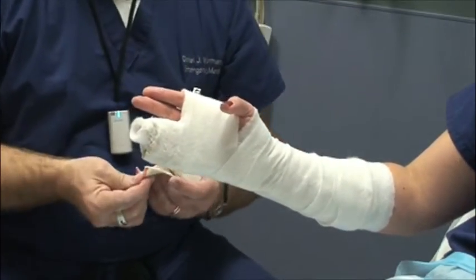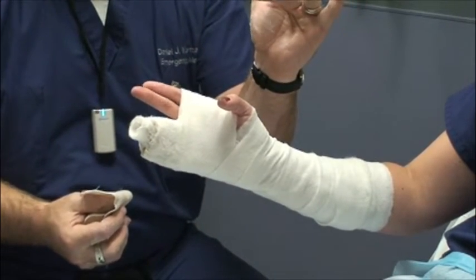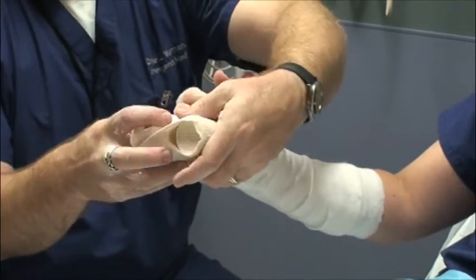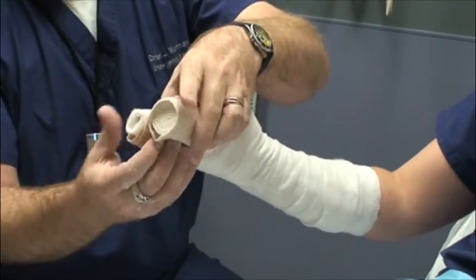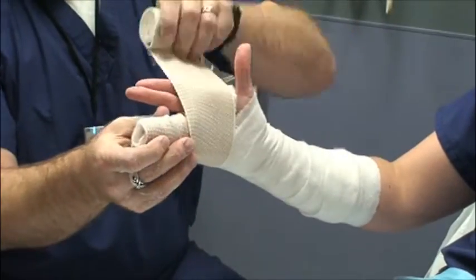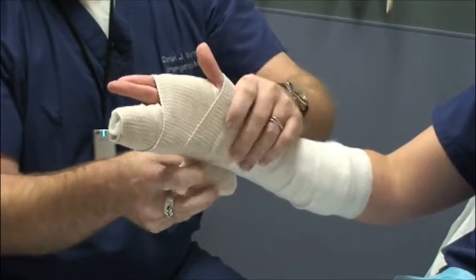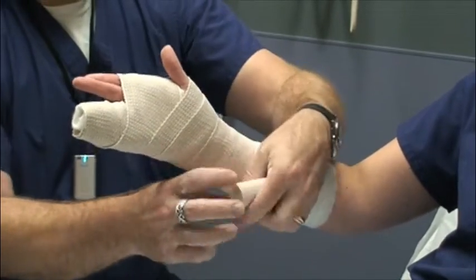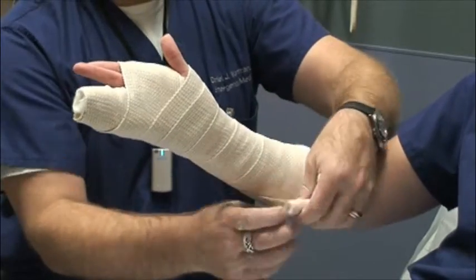Sometimes it's easier if they can bend their fingers in; sometimes they can't and you just kind of work around by pulling a little bit and tucking it in. Lock first, then — not pulling too tight — cover about 50% with each additional wrap. Sometimes one wrap will be enough; sometimes you'll need an additional one.